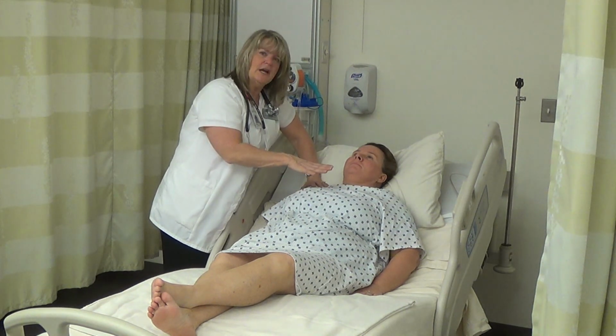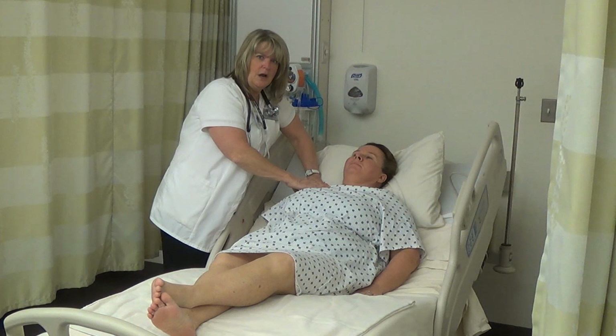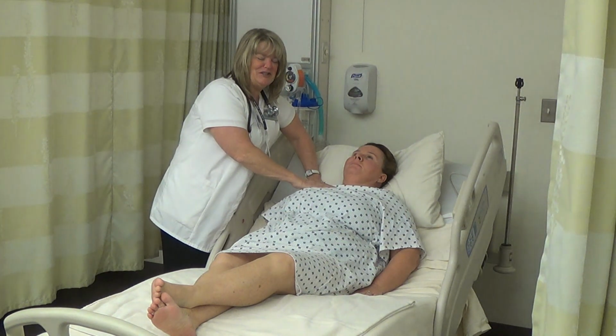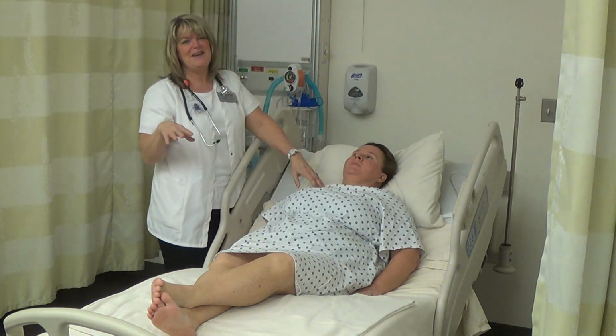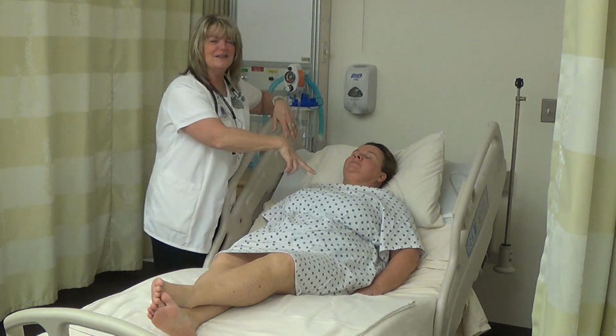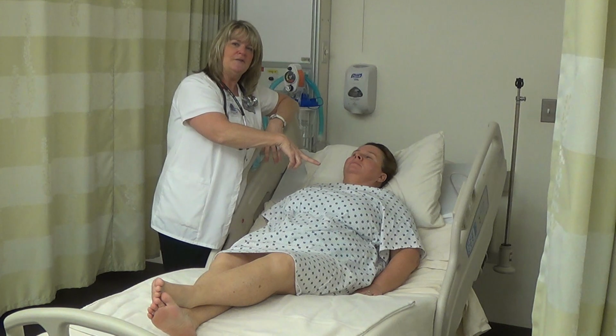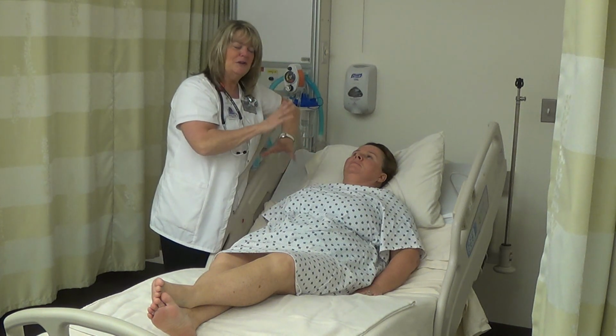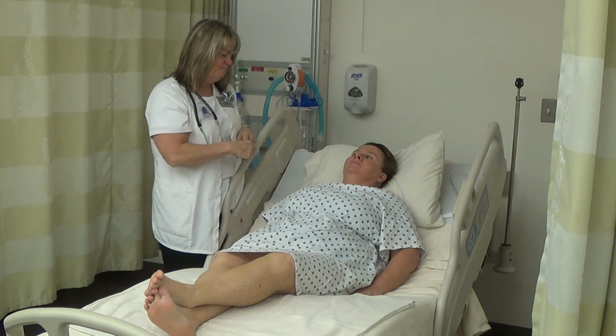So while I'm on the chest, I would still listen to her respiratory rate, just kind of pretending that I'm listening to her heart. So when you do your head to toe, that's kind of a nice trick to do. Listen to her heart sounds, and then just continue to leave your stethoscope there, and then pay more attention to the respiratory rate. And then you'll have both of those assessments done.